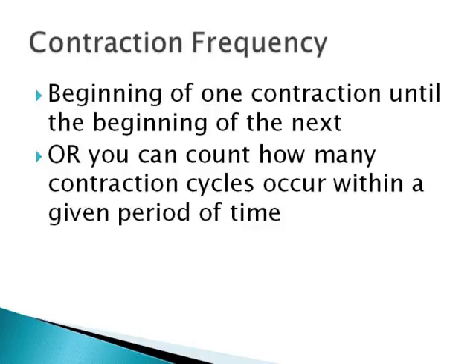Contraction frequency. They're measured from the beginning of one contraction until the beginning of the next one. Or you can count how many contraction cycles occur within a given period of time.